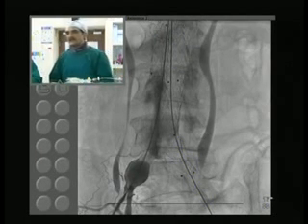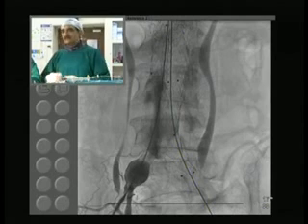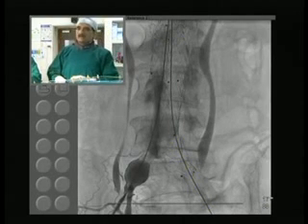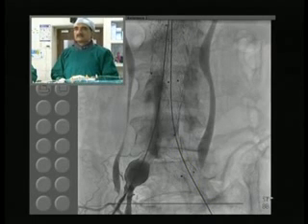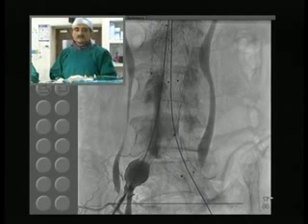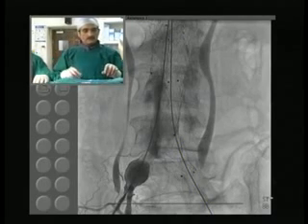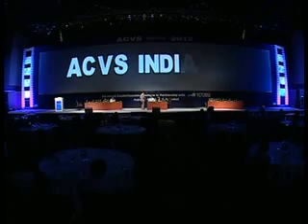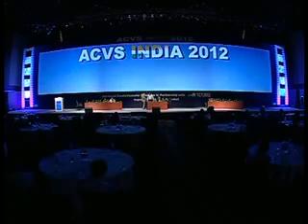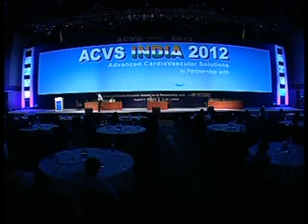Yeah, that's fine. We just have to deploy this and balloon it and then we'll be done. You could come back. We can show you what we have done. Right. So we will come back after 10 minutes and you show us what you have done. Okay. Sure. Thanks, Jim. Yeah. You ready with the device? It will bleed a bit.